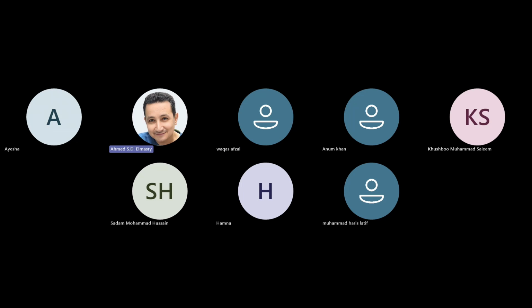So you have to adjust the inflation point and make it at the same level of the dicrotic notch. Like that, the intra-aortic balloon inflation will happen during the diastole. It will not happen during the systole. So it will help the heart instead of working against the heart. Because what happens during early inflation is that the balloon is inflating during the systole, before closure of the aortic valve.